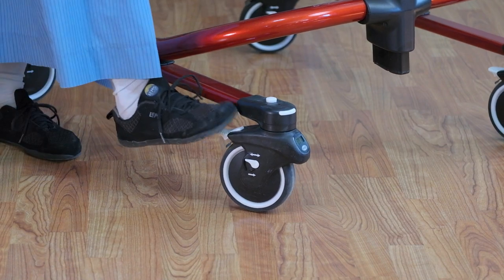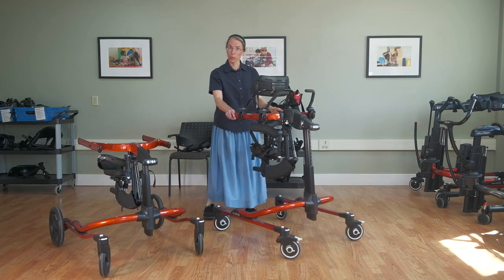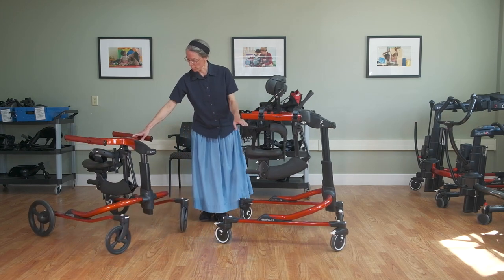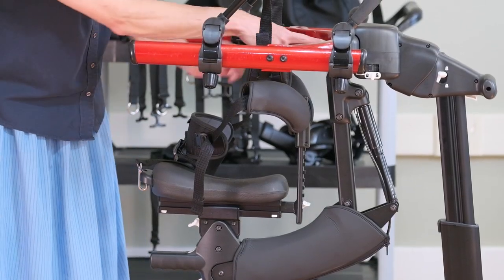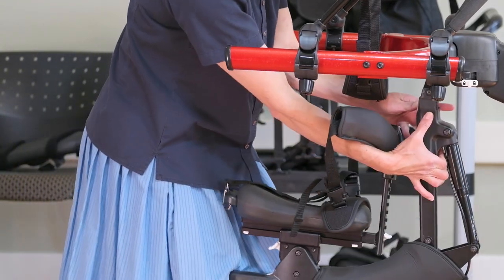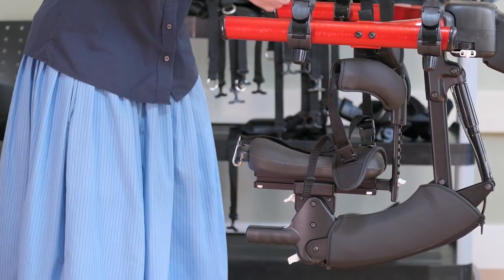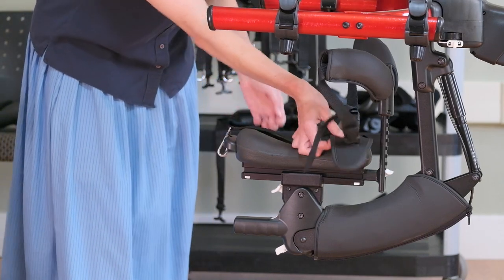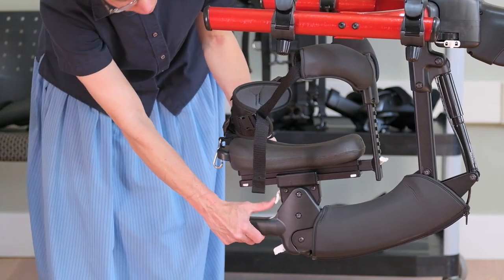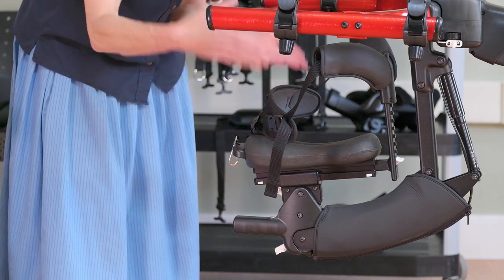Some newer accessories include the multi-position saddle, which attaches here with these white buttons. There are two buttons for added safety so it's unlikely to come out unless an adult is intentionally removing it. There's an angle adjust for the seat or saddle, as well as a forward-and-back adjust, so there are a bunch of positions — you can really fine-tune the position of the hips relative to the shoulders.